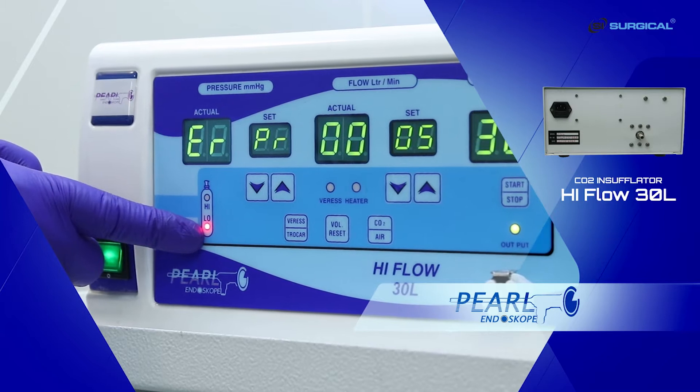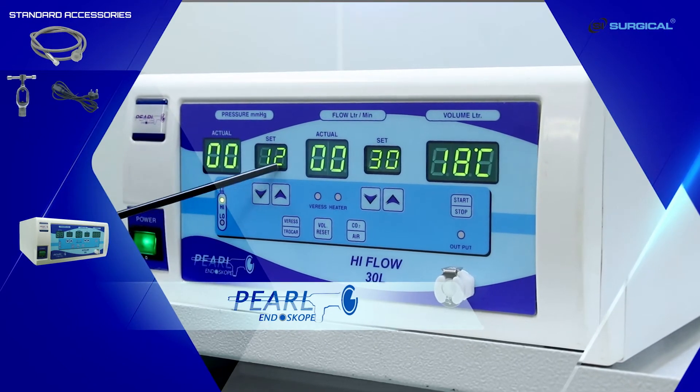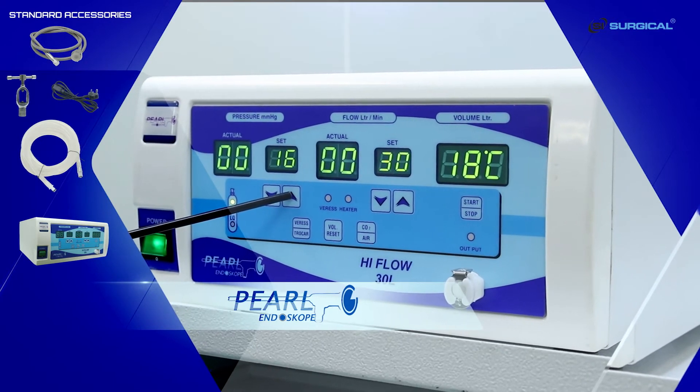There are two buttons for pressure: actual and set. These are the lower key and the upper key for the set pressure. This display shows the actual pressure of the patient.